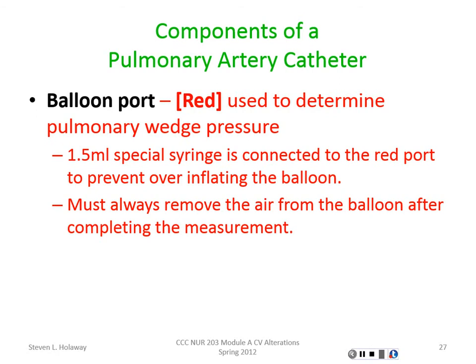Now, I cannot leave this up for very long periods of time. If I leave that balloon up, I'm occluding the blood flow going through, and I can cause a necrosis of that section of the lung. So I have to be very careful when I'm blowing that balloon up, how long I leave that balloon up, how long I leave it wedged. So it's very important. We do the wedges about every 2 hours, or as the physician orders, 2-4 hours.